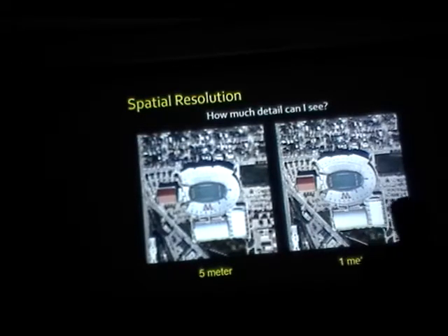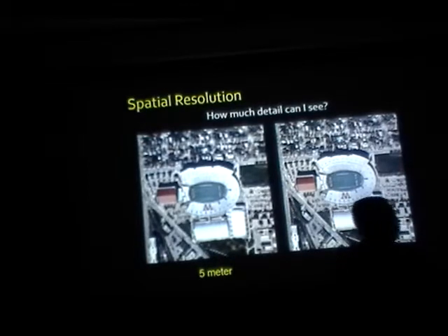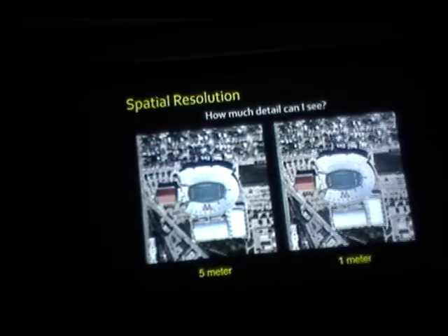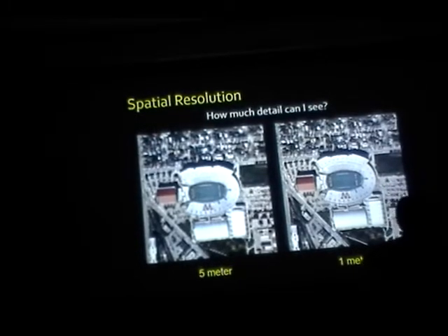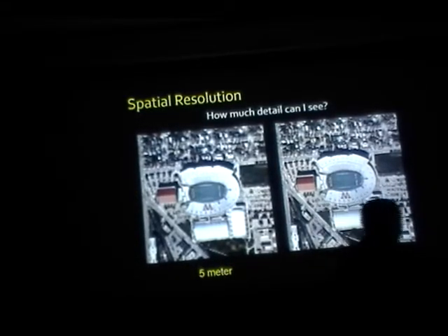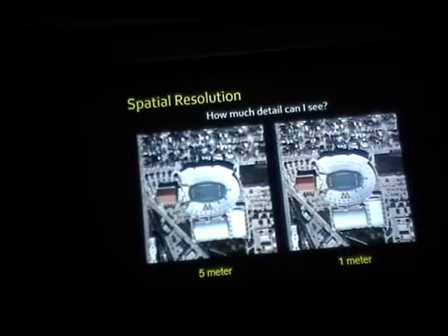For instance, if there is an incipient dental caries or not, right? You want to treat that or not, that's a different question. But if you want to identify if there is an incipient dental caries or if there is a fracture, then you need to have a good spatial resolution.